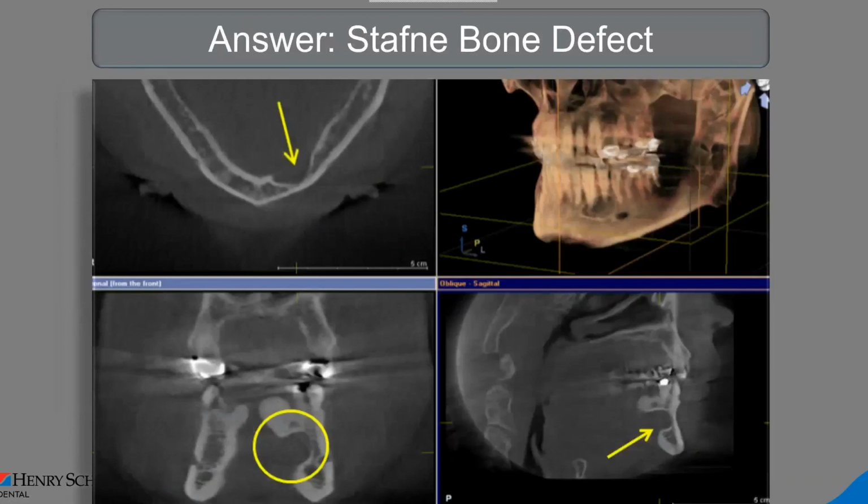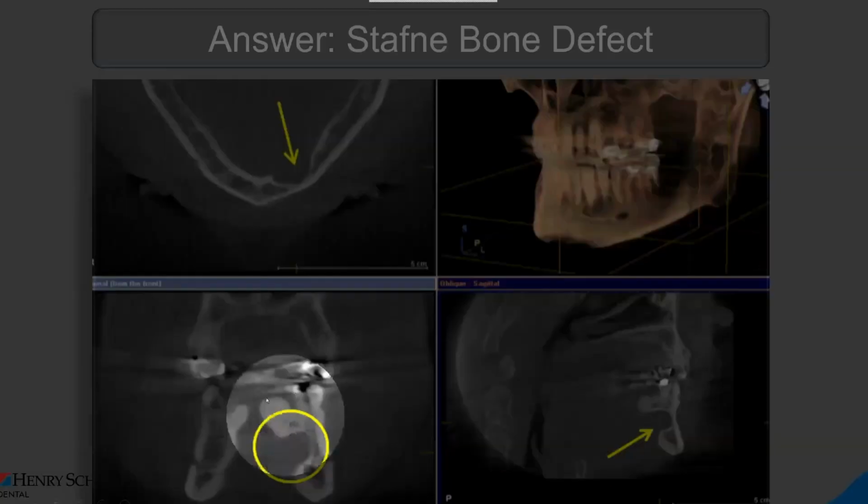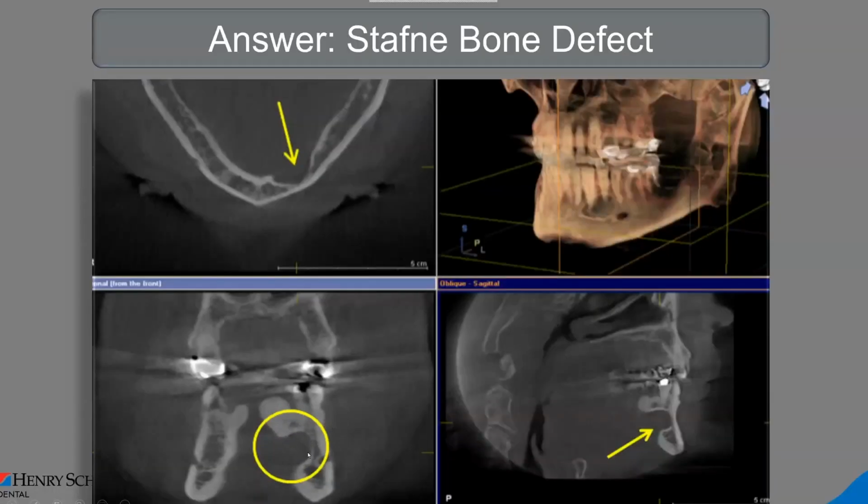So if we're looking at this, we see, yeah, we have a large lingual tori, but definitely we have something that is peripherally pushing on the bone, remodeling it, with nice, thick, intact cortical borders. Nothing we need to do about this.